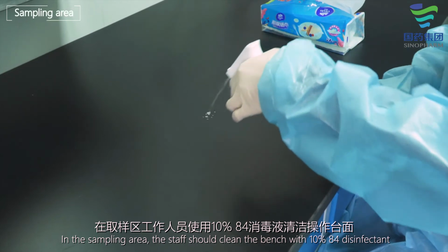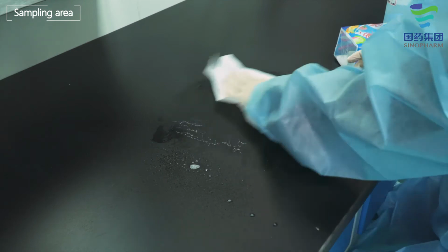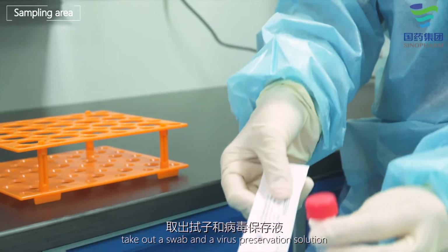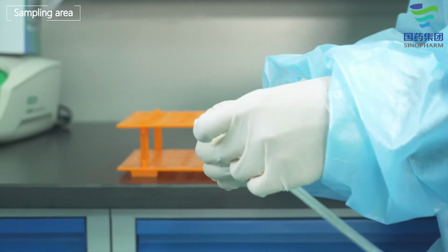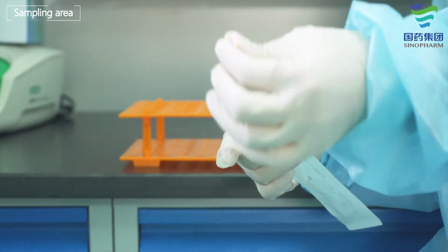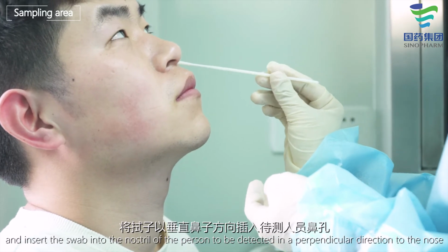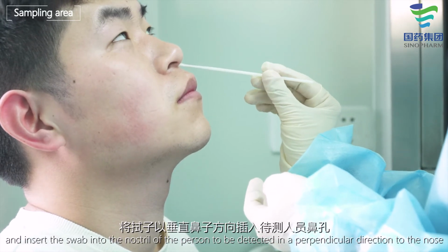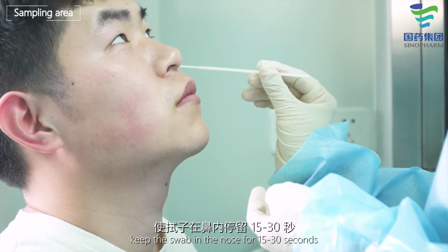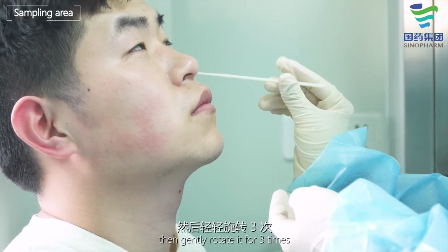In the sampling area, the staff should clean the bench with 10% 84 disinfectant. Take out the swab and a virus preservation solution. Insert the swab into the nostril of the person to be detected in the perpendicular direction to the nose until feeling there is obstruction. Keep the swab in the nose for 15 to 30 seconds, then gently rotate it 3 times.